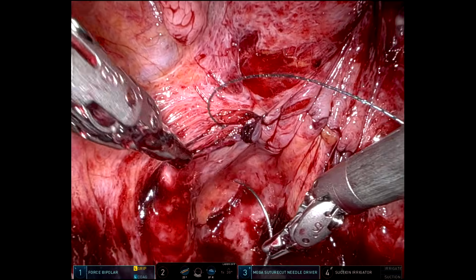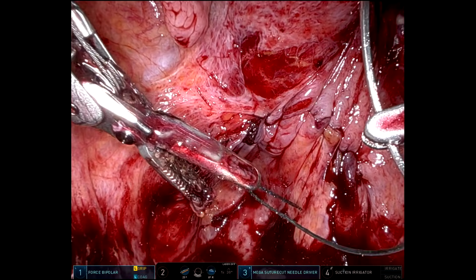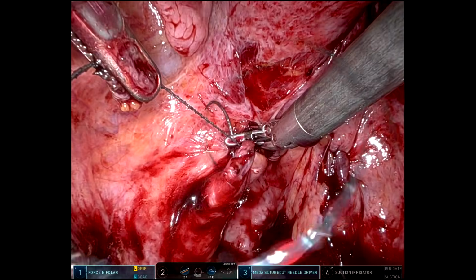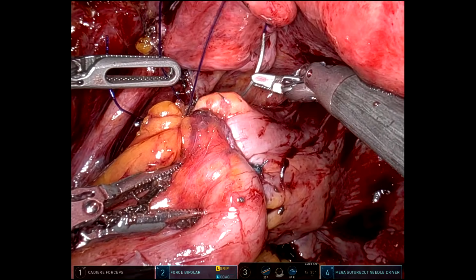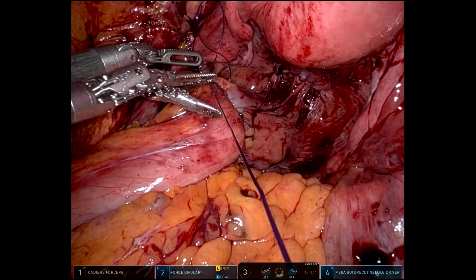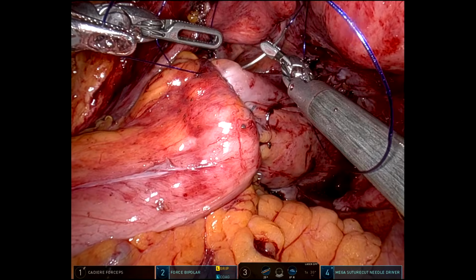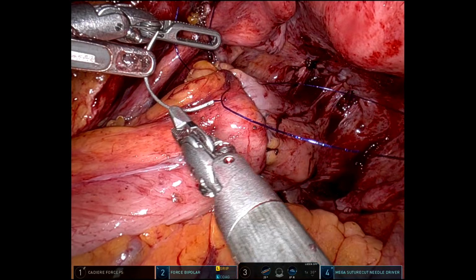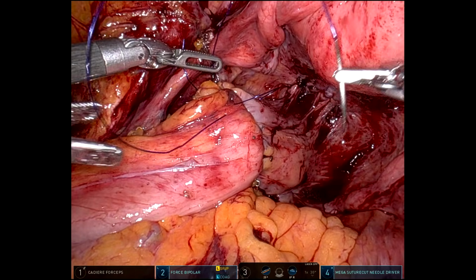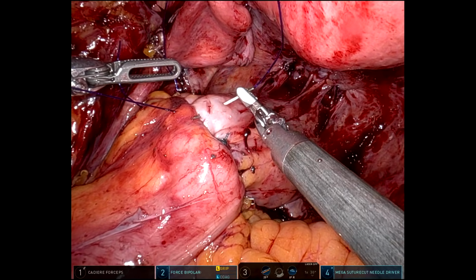You have to be careful when you're doing this. Your camera is in 30 up, but it's actually below your sacral promontory, as are your hands. And so as you're suturing and moving the camera or pulling towards the camera, you can actually bang directly into your sacral promontory and cause bleeding from the presacral venous plexuses. So you really have to be careful. That's why you saw the fellow pulling through kind of like this right here, not pulling too far and definitely not off screen.